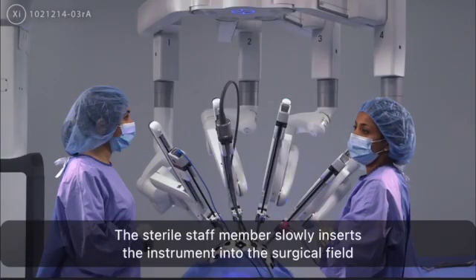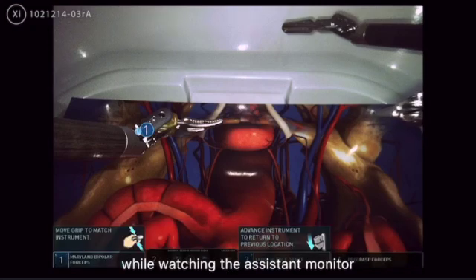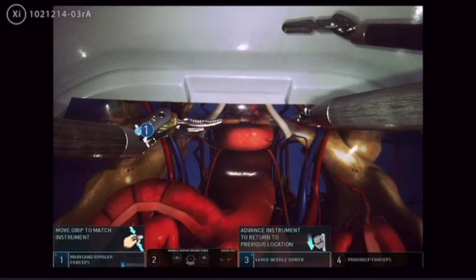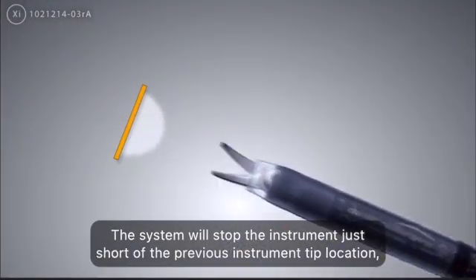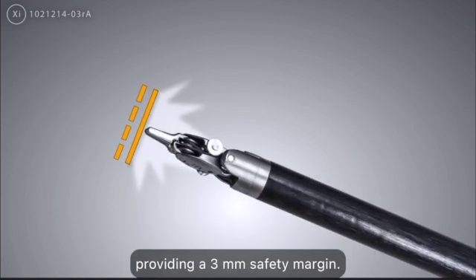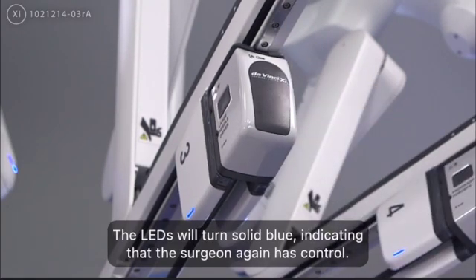The sterile staff member slowly inserts the instrument into the surgical field while watching the assistant monitor and stops when resistance is felt. The system will stop the instrument just short of the previous instrument tip location, providing a 3 mm safety margin. The LEDs will turn solid blue, indicating that the surgeon again has control.